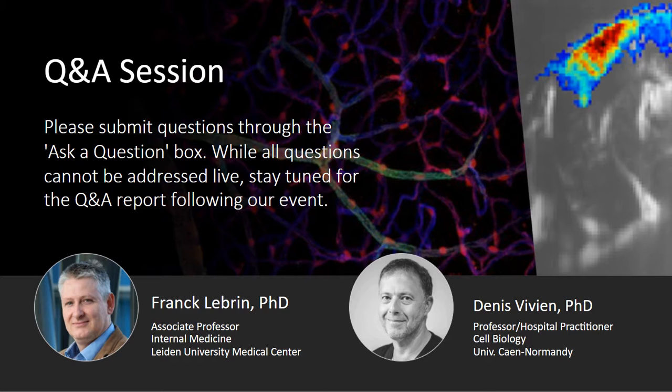And now we have models in which we can induce stroke by local clot formation, and we can monitor the composition of the clots, either rich in fibrin, which means these kinds of clots are sensitive to the gold standard treatment, rtPA, or rich in platelets, and they become resistant to tPA. So exactly mimicking the main clinical situation.